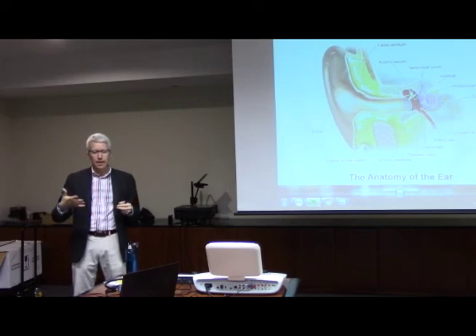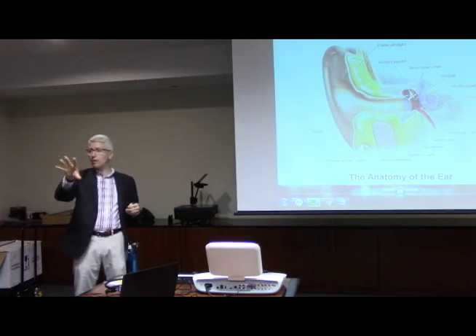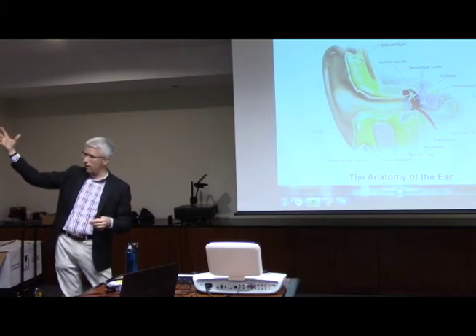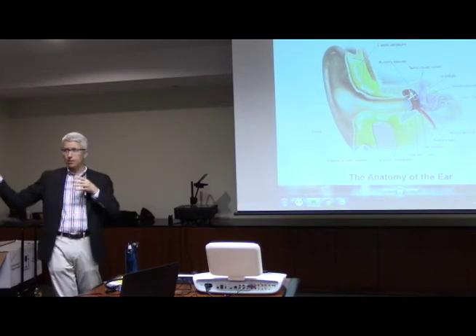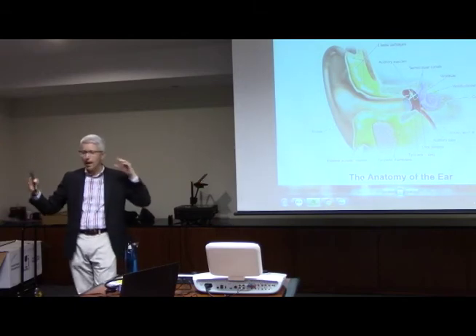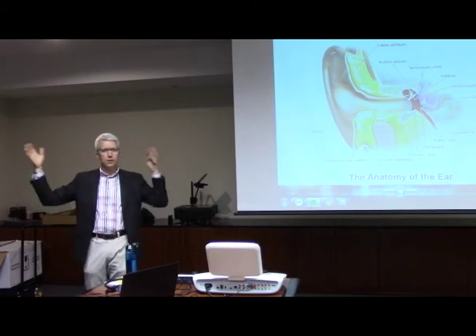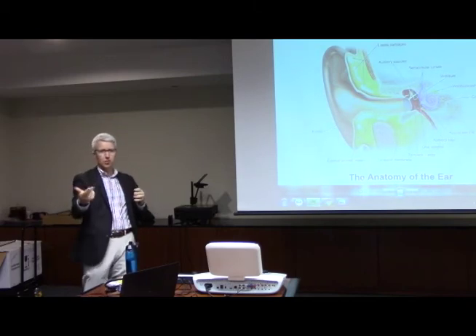Visual reinforcement is where you get the child looking ahead. Sometimes you'll use somebody or a lighted toy to keep their attention there. Play a sound through the speaker. When they look over there, you either light up a toy or a video panel or something that gets their attention and rewards them for looking that way. Then you bring their attention back to the center, and you do another one, and they look that way, and you reinforce it. So you're reinforcing them looking back and forth at the appropriate time, and then keeping their attention going forward.